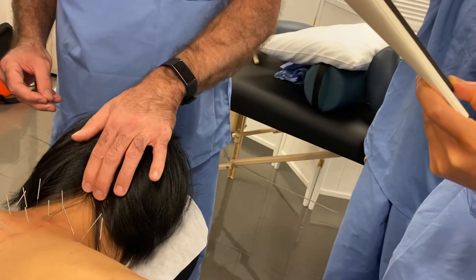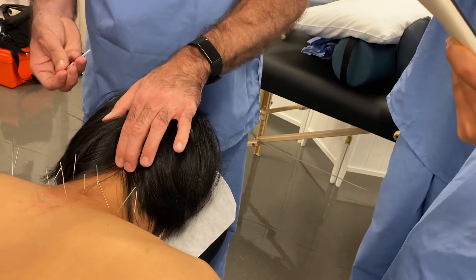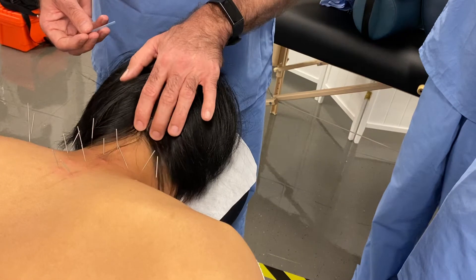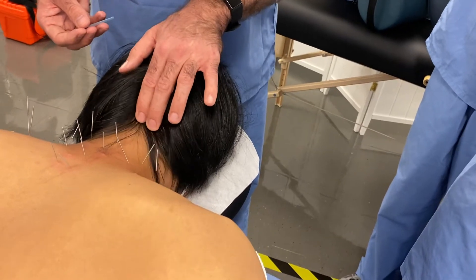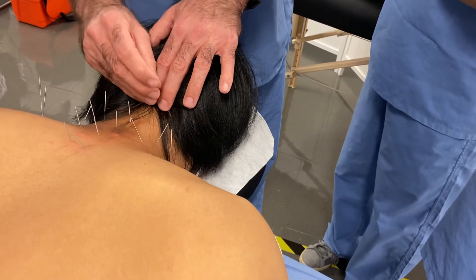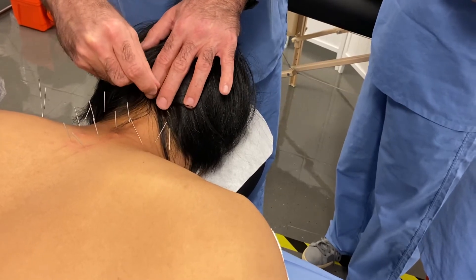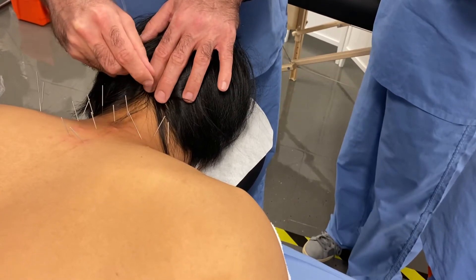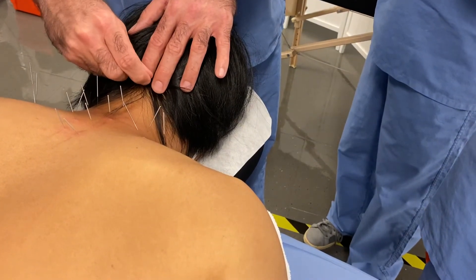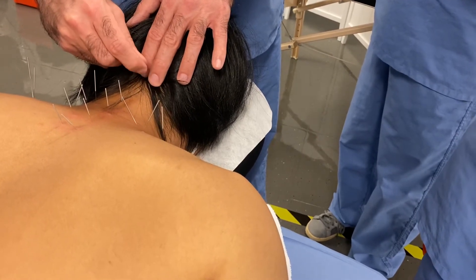So in this one, unlike the trapeze where I have both feet on the wire, I'm straddling the wire — on the medial side and the lateral side of the wire, with the center of the wire in between. I'm going to come down straight towards the floor, maybe with a slight tilt towards me, and a gentle little in-and-out.